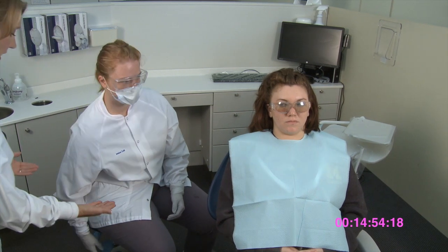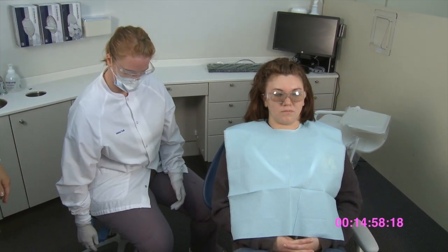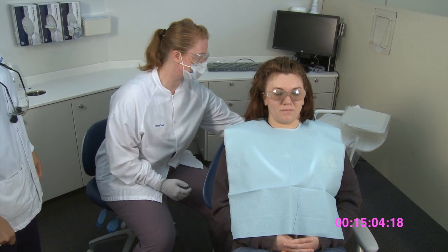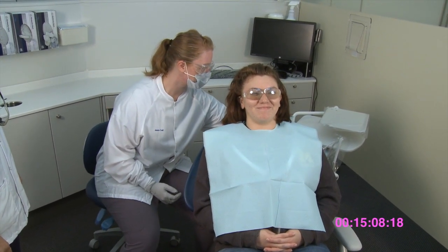First, the student is adjusting the chair so that her thighs are mostly parallel to the floor, yet her feet are flat on the floor. Next, she will adjust the patient's chair height for correct positioning. Notice that this can take several tries to get this exactly right.